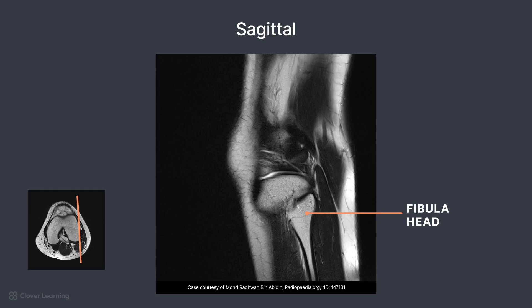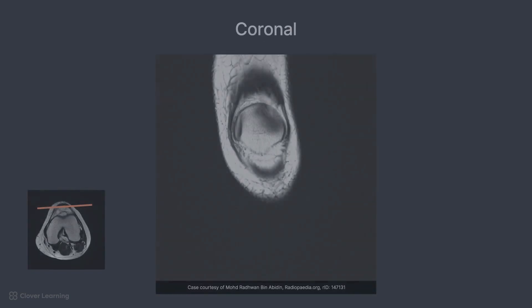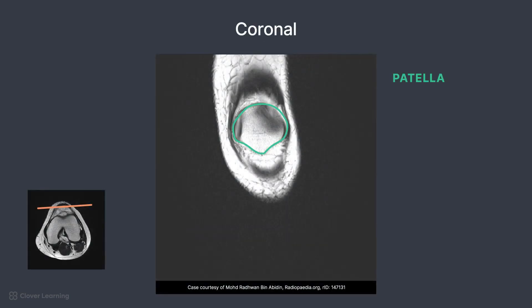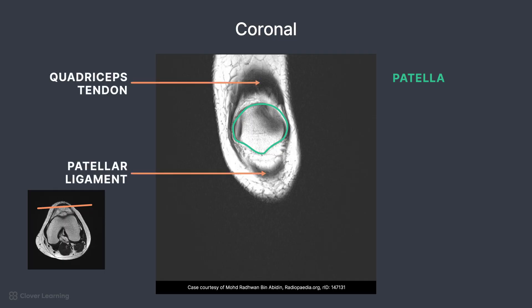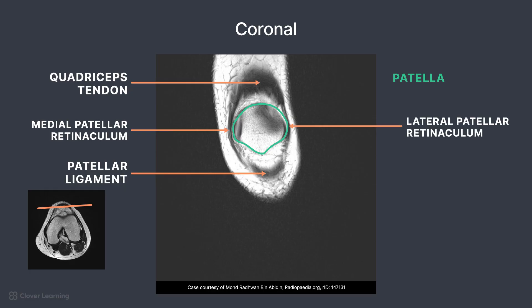Let's move on to the coronal plane of imaging. Starting anteriorly, the round-shaped patella emerges. Remember, the patella is classified as a sesamoid bone and is the largest sesamoid bone in the body. The quadriceps tendon is located superiorly and the patellar ligament is located inferiorly. On the sides of the patella, you can see the medial patellar retinaculum and the lateral patellar retinaculum.